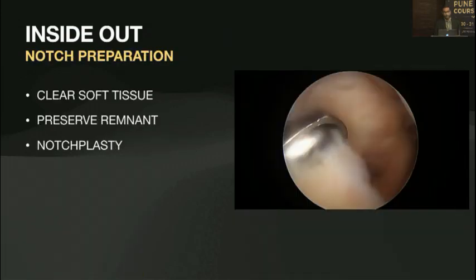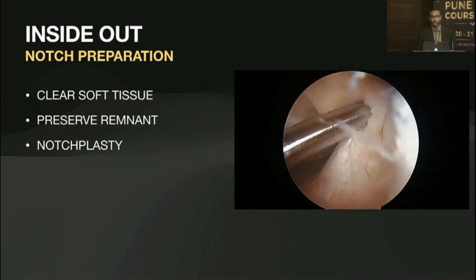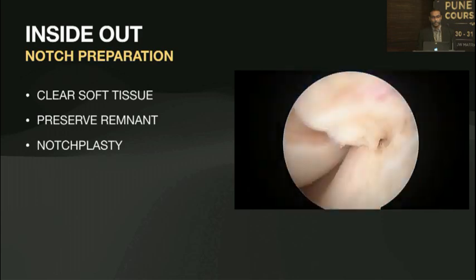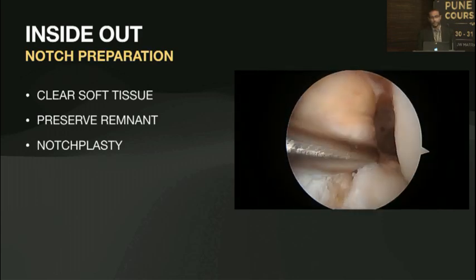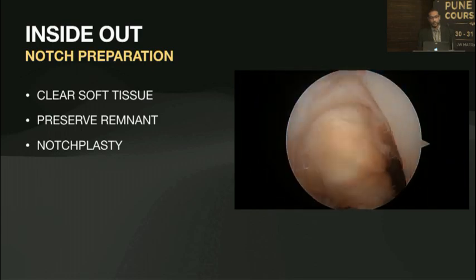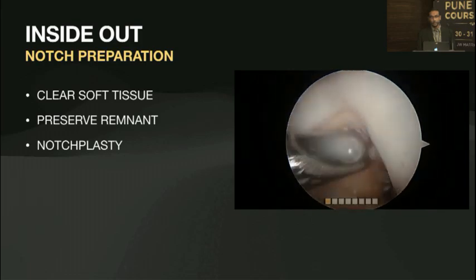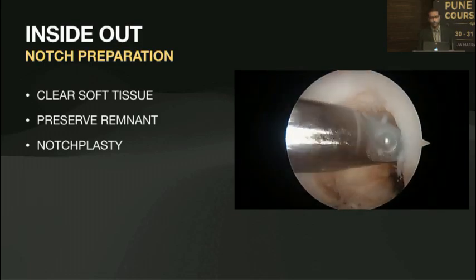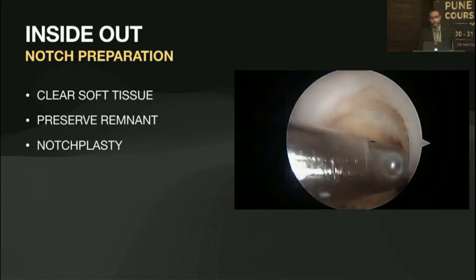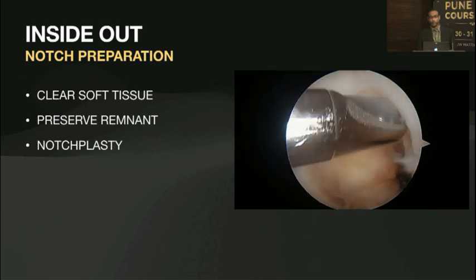Clearing the soft tissue is important. The fat pad, if you start dissecting it, will start to swell up, so you don't want to dissect too much — just release it off the notch. You have to clear the soft tissue at the footprint. If you're an early surgeon, get your anatomical landmarks clear; don't try to preserve as much tissue as possible because you may put your tunnels in the wrong place. You have to do a notch plasty in case it's a very narrow notch, and it also helps with visualizing from the anterolateral portal across into the footprint.